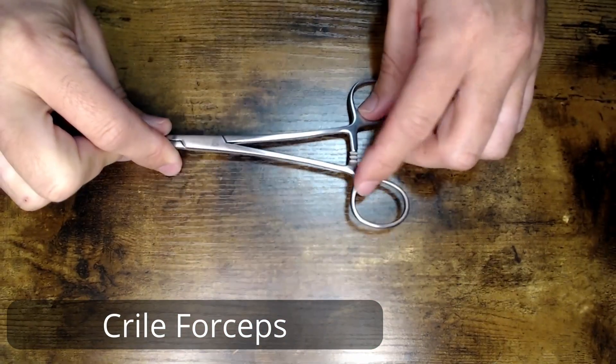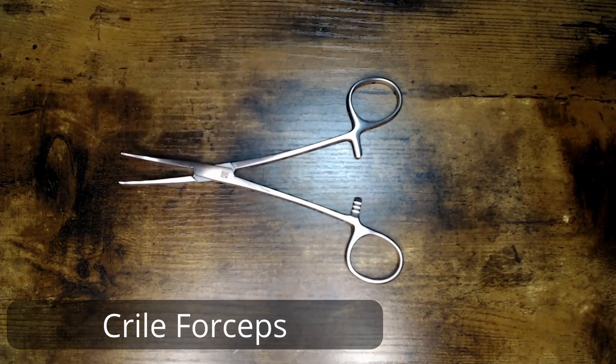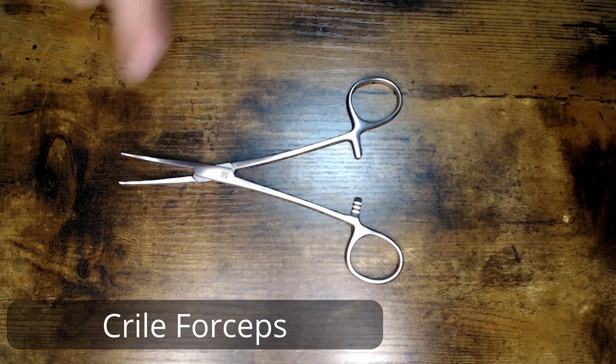Again, this is your Kryal Forcep, also known as a Kryal Hemostat. This particular variation is six and a quarter inches and it is the curved. Thank you for tuning in for this episode of Hello My Name Is. Until next time, keep fighting dirty.